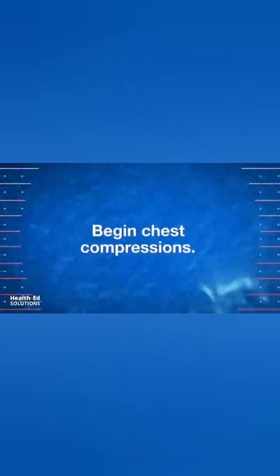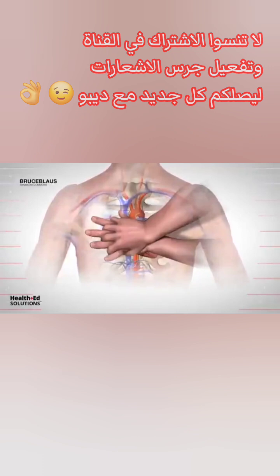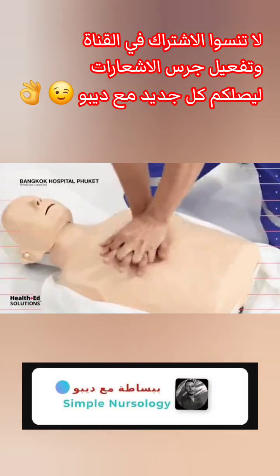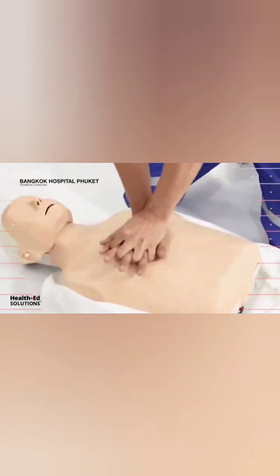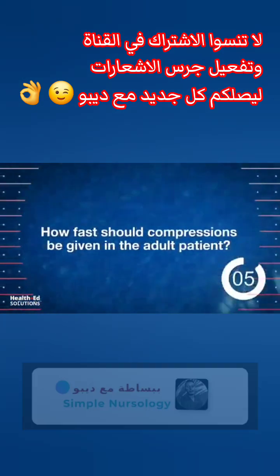Begin chest compressions. Landmark by placing both hands, one on top of the other with the fingers interlaced, between the nipples and just slightly below the nipple line. Compress the center of the chest, lower half of the sternum, allowing the chest to return to its natural position in between compressions. How fast should compressions be given in the adult patient?